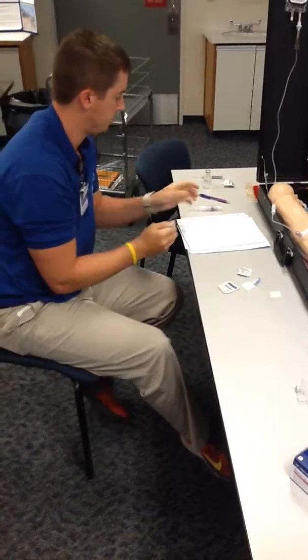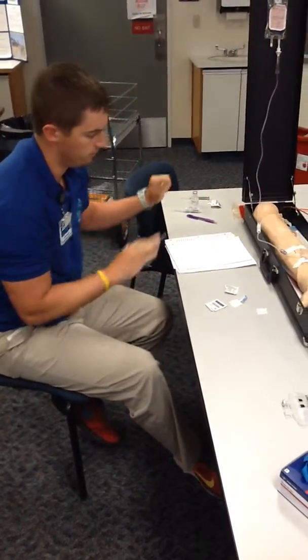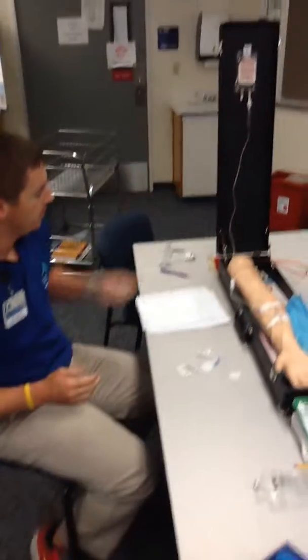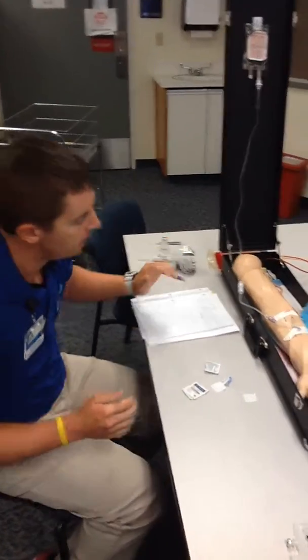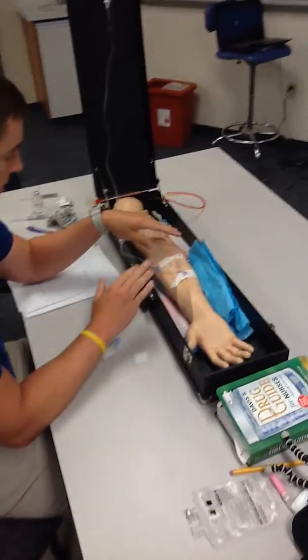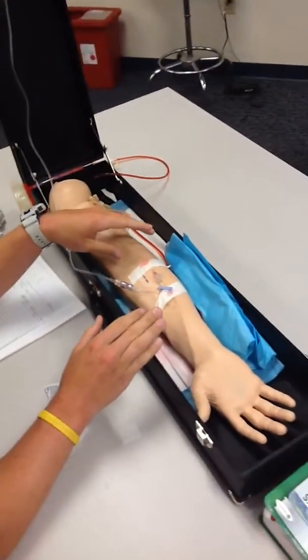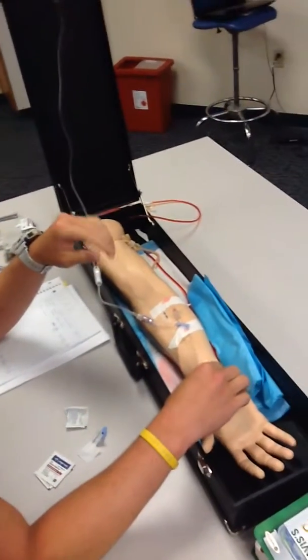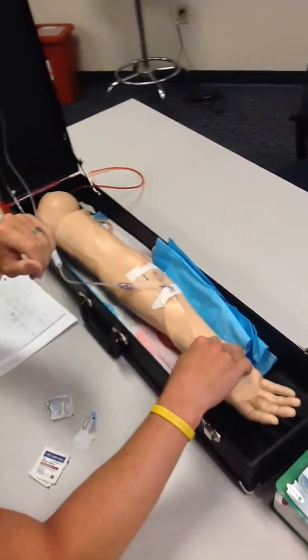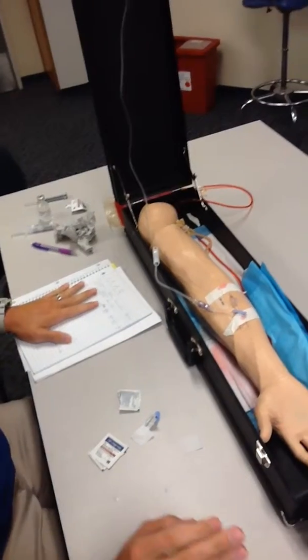I take everything that I brought into the room, the swabs, the saline, everything, and throw it in the appropriate container. I will come back just under 2 hours because we don't want the bag to totally empty itself. I will reassess the client. I will check the area. Everything looks good. I don't see any inflammation. Is there any pain like before? No. Can I get you to just recheck your name for me? Alright. So name and everything matches the MAR as before.